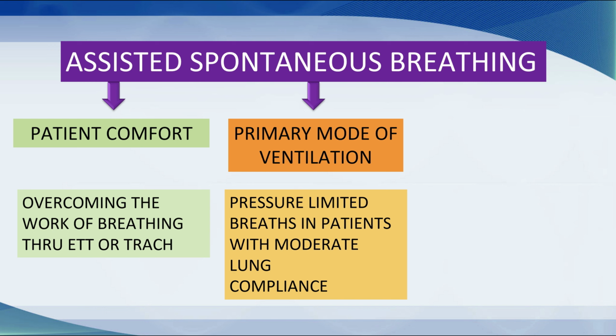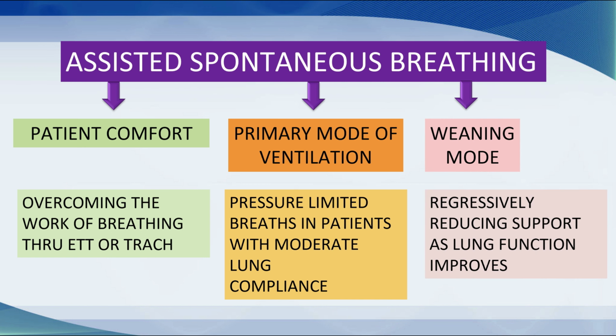Certainly someone with very poor lung compliance with severe ARDS will find it very hard to inflate their lungs because their lungs are essentially concrete. So you're usually looking at patients who are either recovering from ARDS or have moderate levels of lung disease and the lungs are reasonably compliant. And finally, it can be used as a weaning mode where you progressively reduce the support as lung function improves.